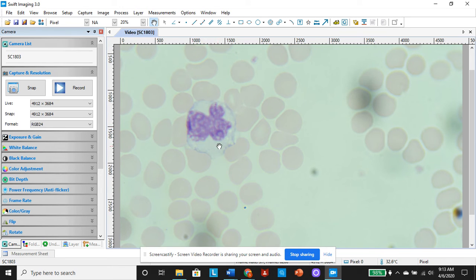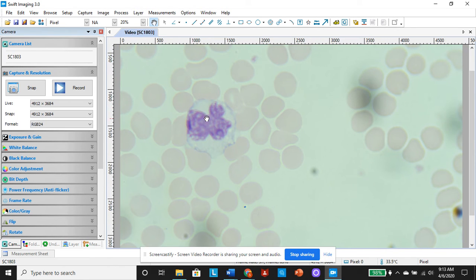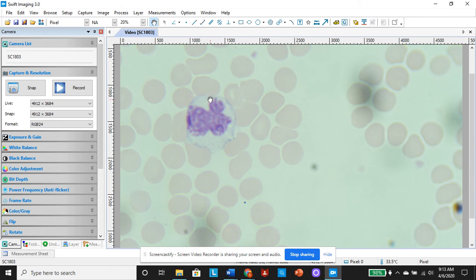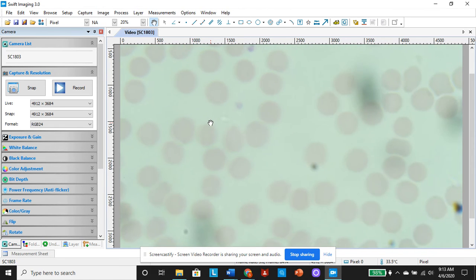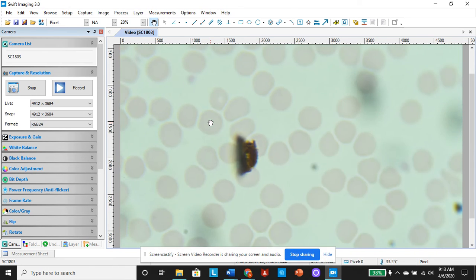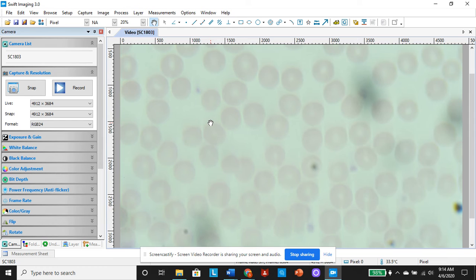This guy is the one that's going to be eating your bacteria, and sometimes you'll see vacuoles in it, like big holes of white space, and that's probably where they've eaten something. And it's not like they keep going after they eat something. Once they get something in them, they're pretty much done. So your body is continuously generating these white blood cells to replace the ones that are being destroyed and used up, doing their job and serving their purpose. It's pretty neat. Your body is always creating all these cells continuously.